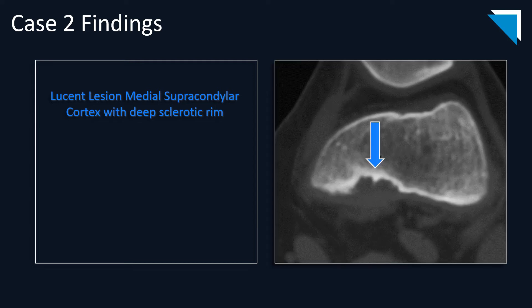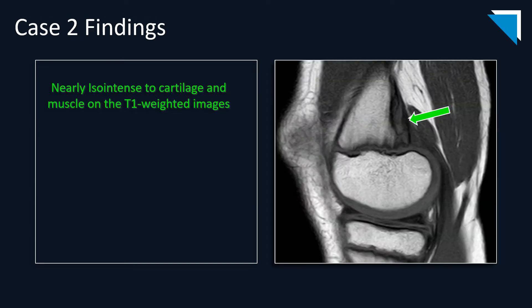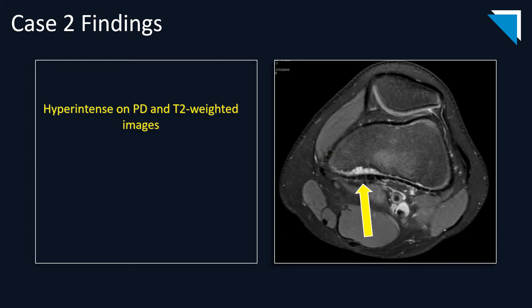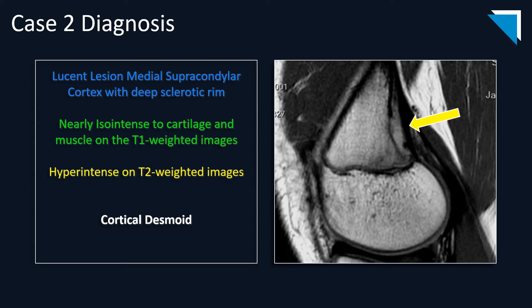On CT, you will see a lucent lesion with a deep sclerotic rim. On T1-weighted MR imaging, this lesion is nearly isointense to cartilage and muscle. On PD and T2-weighted imaging, the lesion will be hyperintense. The diagnosis is a cortical desmoid: a lucent lesion within the medial supracondylar cortex with a deep sclerotic rim on radiographs and CT, nearly isointense to cartilage on T1, and hyperintense on T2-weighted MR imaging.